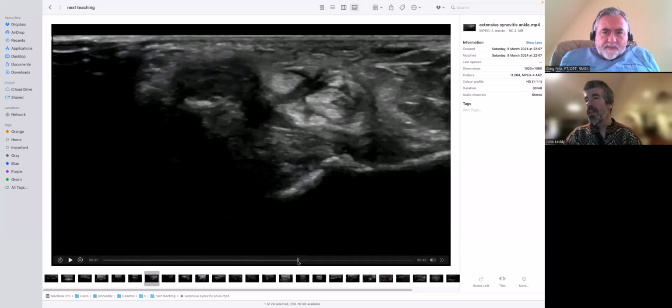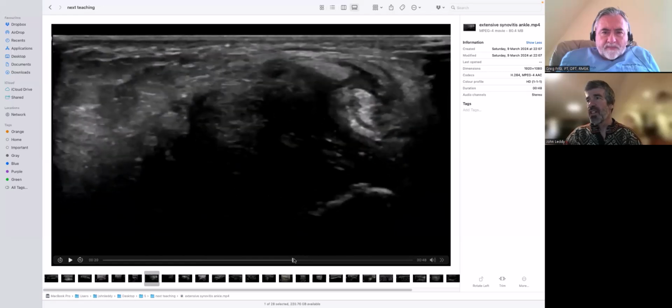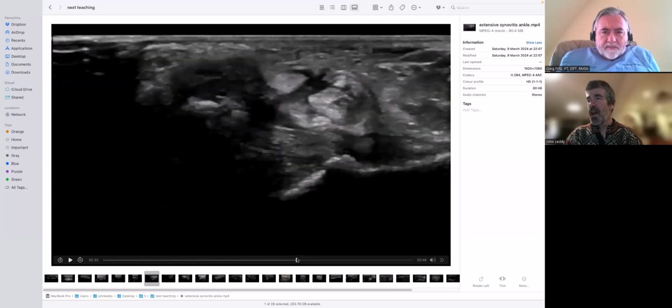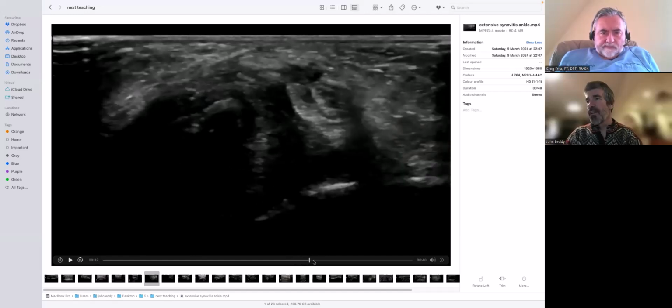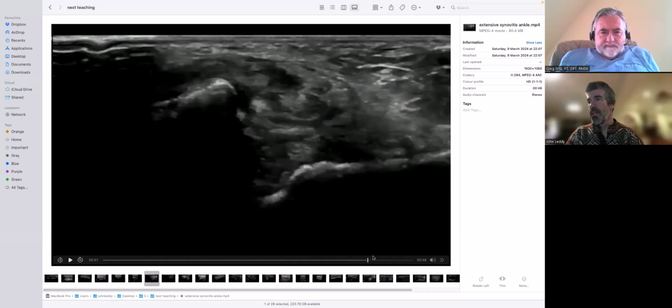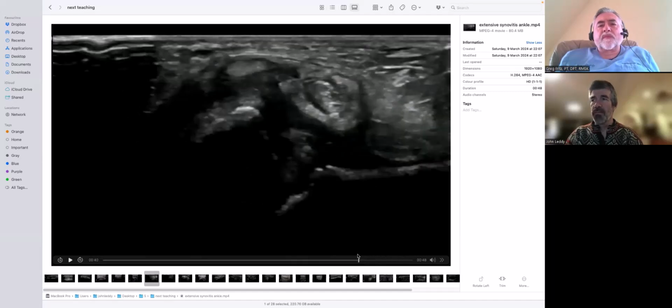I was very convinced when I first saw this that I was going to see some sort of subluxation of the peroneal tendons at this point, but I couldn't get them to jump over, though they moved around in the sheath. So there was obviously some sort of injury. But there's synovitis under this, the CFL ligament, and synovitis here under the joint. This all has a very inflammatory look to me, so they will have gone off to be reviewed by rheumatology.